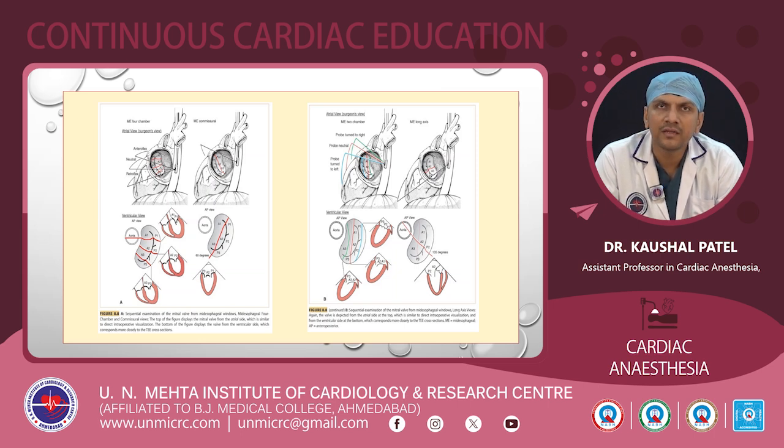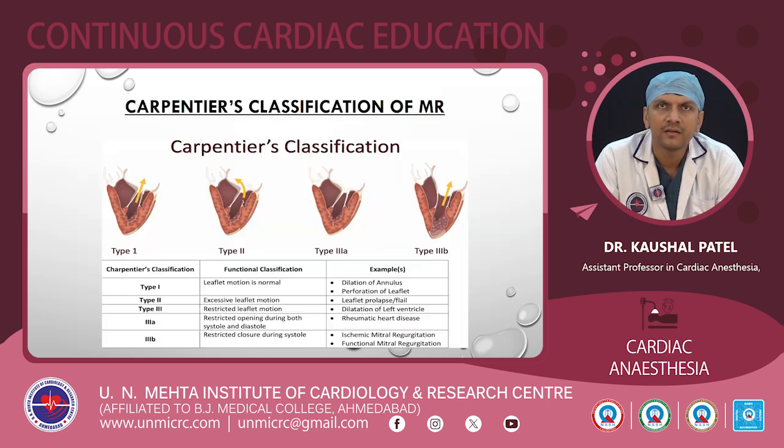The septal leaflet of the tricuspid valve is slightly lower, that is, more apical, in the normal anatomy. If the septal leaflet of the tricuspid valve is at the level of the anterior mitral leaflet, that corresponds to A3, P3. So from a single view, like the mid-esophageal 4-chamber view, we can evaluate all three segments of the mitral leaflets: A1, P1, A2, P2, and A3, P3.